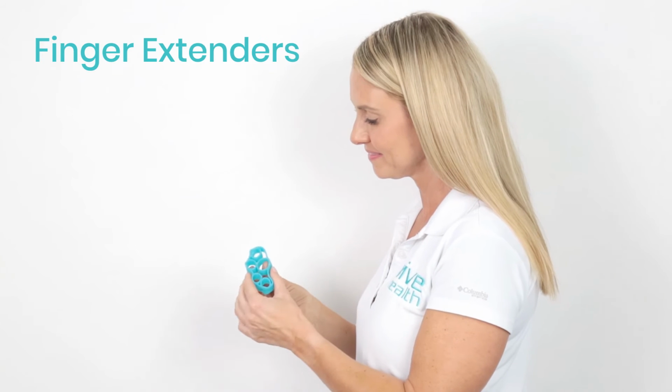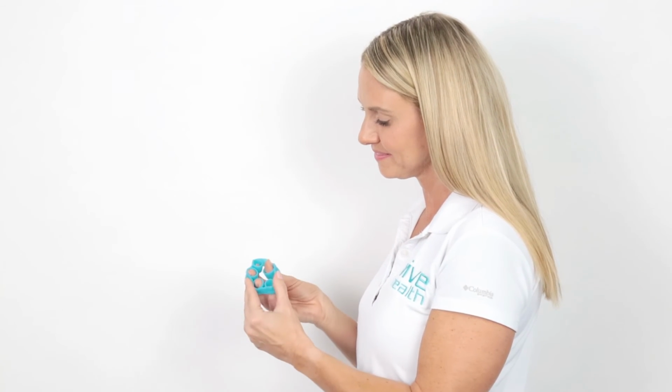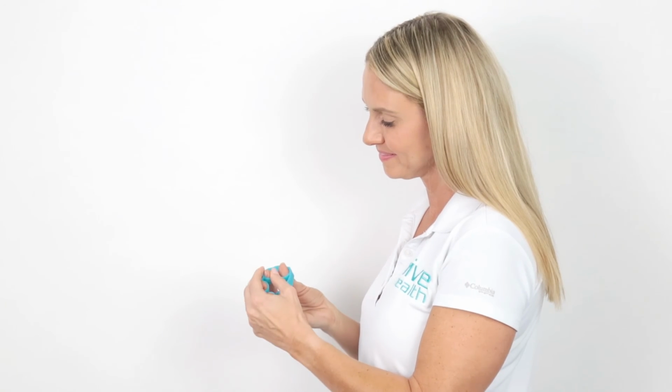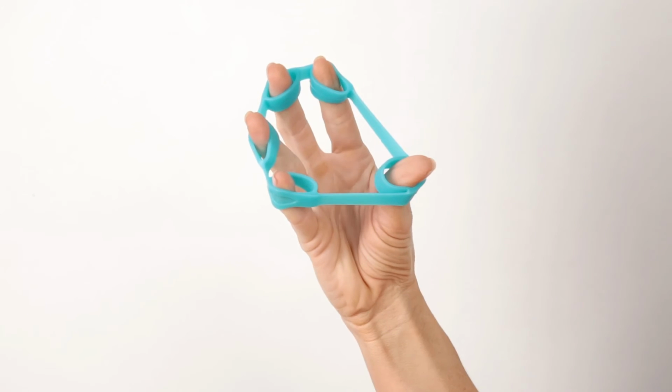Finger extenders. Use these similar to the stretching method in the ring grips. Place your thumb in the hole that is separated from the other 4 closer together holes.